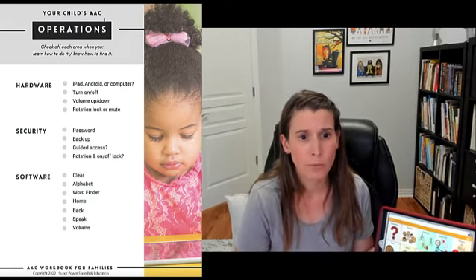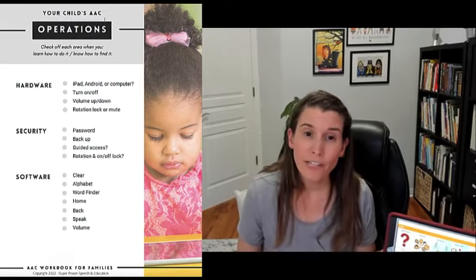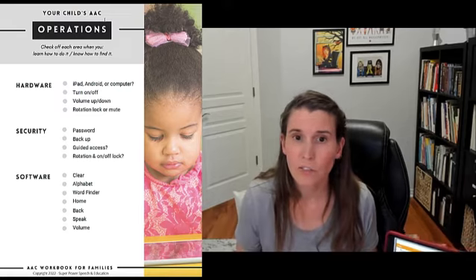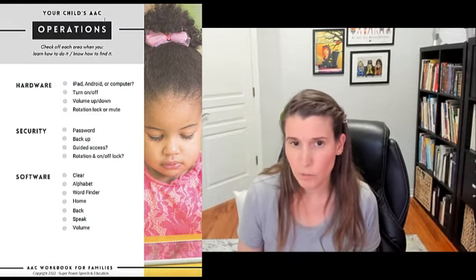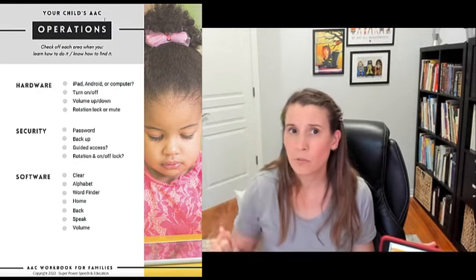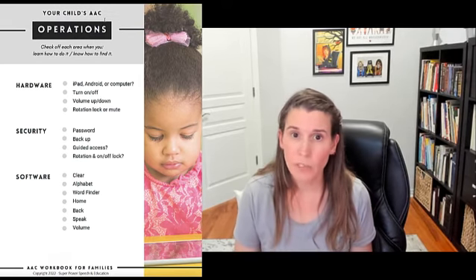So that's really important. It's also important that you learn how to back it up, so that if something were to happen to the hardware, you have it saved somewhere. Now, hopefully your speech pathologist or the company rep can help you with this, but somewhere, on another iPad or in a computer or somewhere, you should definitely have a backup of the system that you put together.